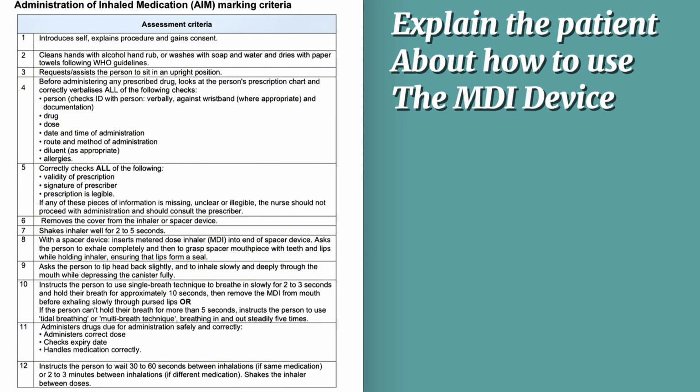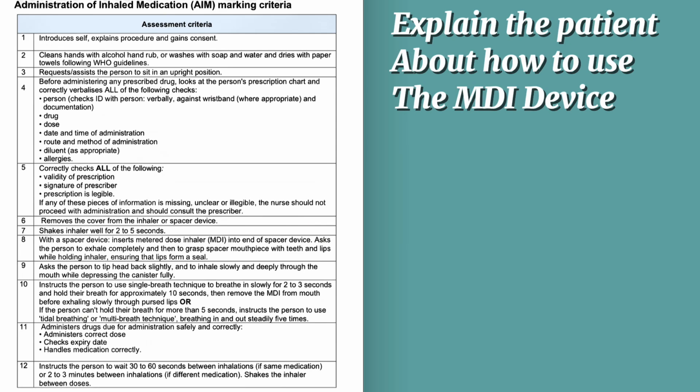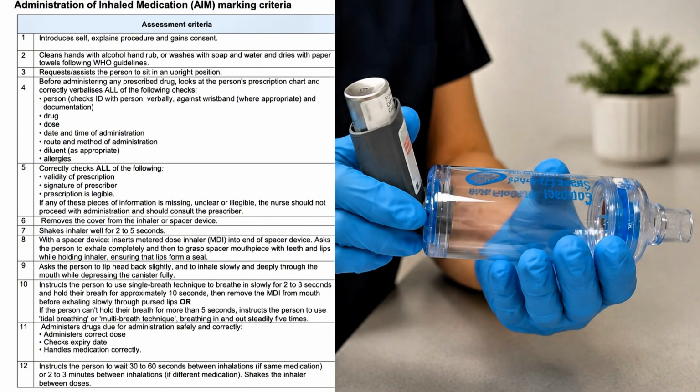Okay, Patricia, I'm going to show you how to use this one. First thing, if the MDI or the metered dose inhaler is new, then shake it 2 to 5 seconds. Then remove the cap. After that, you have to prime it away from you. Make sure to attach the MDI device to the space chamber and also make sure not to touch the key parts.